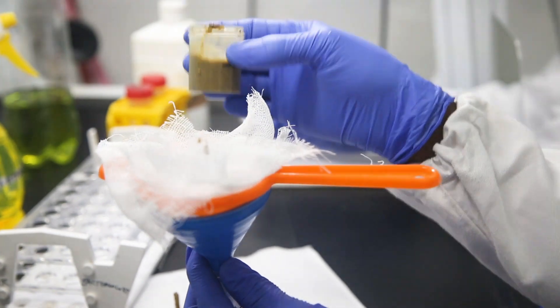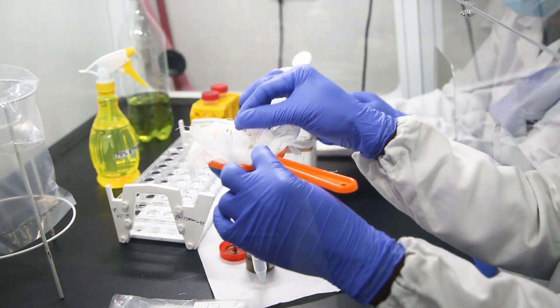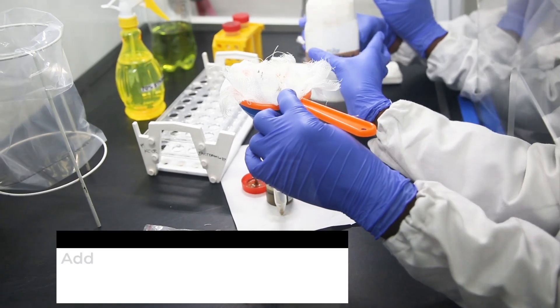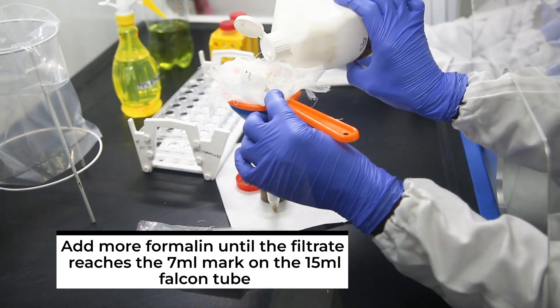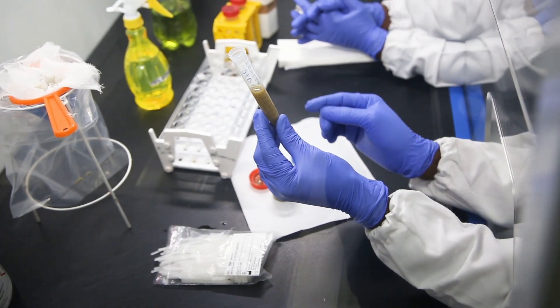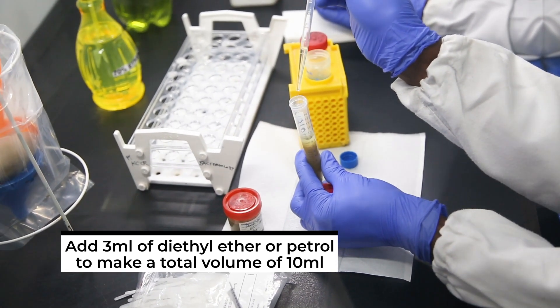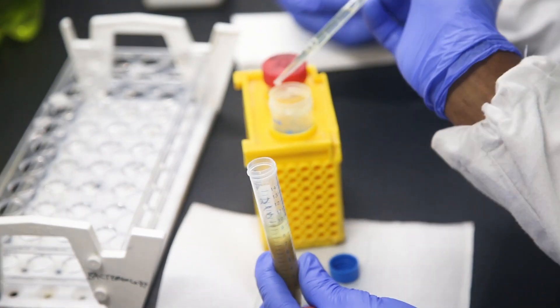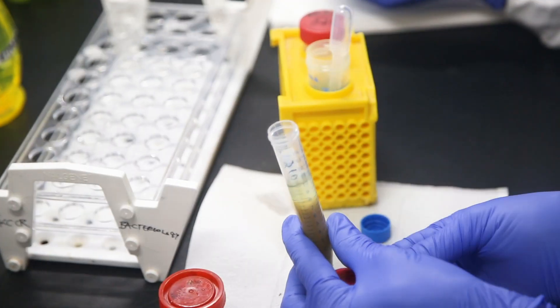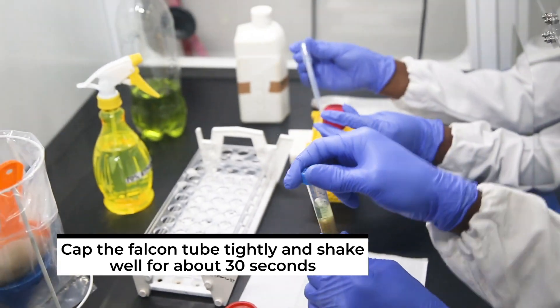The remaining stool sample can be kept for later examination. Add more formalin until the filtrate reaches the 7 ml mark on the 15 ml falcon tube. Add 3 ml of diethyl ether or petrol — in this case we are using petrol — to make a total of 10 ml. The function of the petrol is to dissolve any fat that may be present in the stool to release the parasite. Also, the thicker debris will be extracted into the ether or petrol phase of the suspension. You cap the falcon tube tightly and shake well for about 30 seconds.